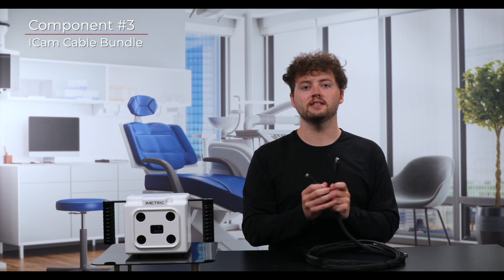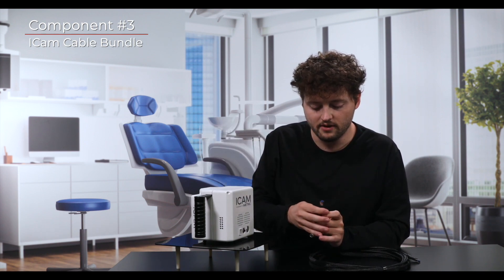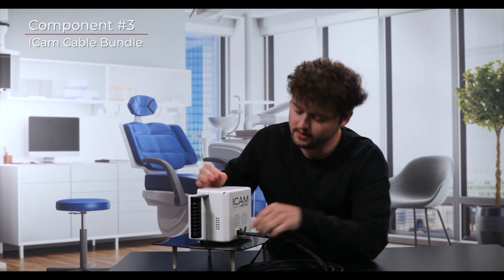Identify the end of the cable bundle that has the USB-B connection and the four-prong power connector side by side. The USB-B connector will be inserted into the back of the iCam in the far left connector. Be sure to check the orientation of the USB-B connector before inserting it into the iCam.